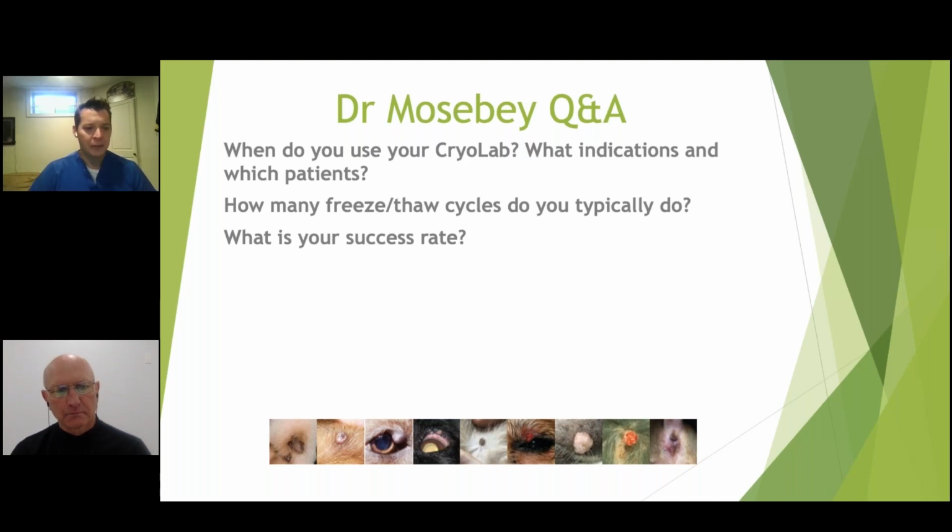I usually expect people, hey, we're probably going to come back and treat this at least one more time. Larger things, if you're treating things 2, 3, 4 centimeters, then I think, especially depth-wise, if we know it's over a centimeter in depth, you're in all likelihood not getting that the first time. That's going to be a definite, hey, come back and let's treat what remains afterwards.